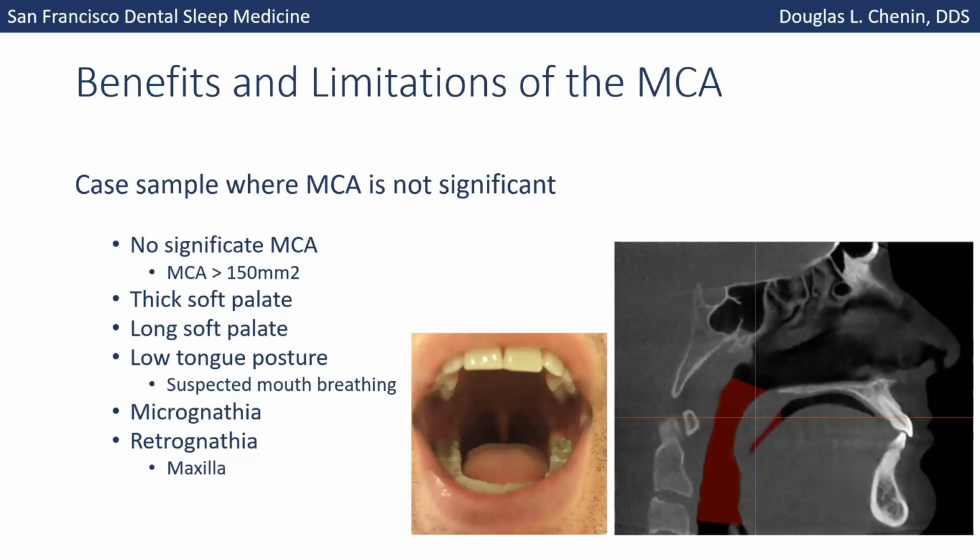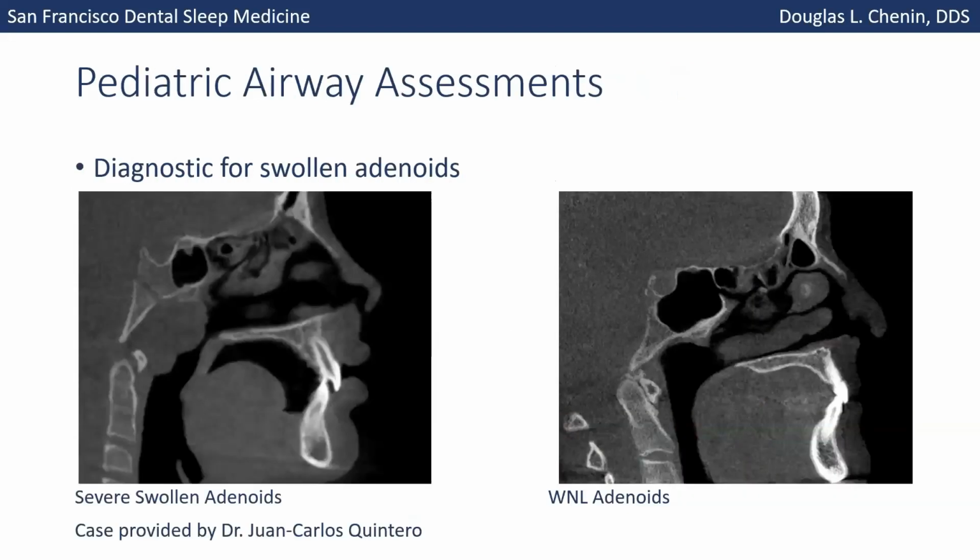But all of that combined with the mouth breathing and the nasal congestion leads to sleep apnea, because the mandible can actually fall pretty far back. So the point of this case is, don't let that minimal cross-sectional area in a big looking airway rule it out, again, because it's not diagnostic. It just points out some patients who are at risk, but it doesn't catch this type of patient. So you have to look into more factors.